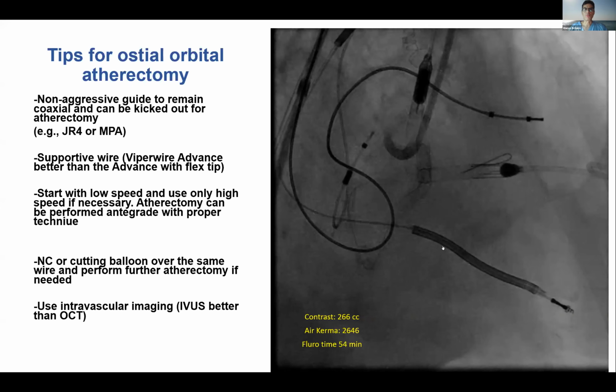The other thing, though, that I found sometimes interesting with these perforations is losing the wire. Sometimes people get a perforation, which is not the most pleasant thing, obviously, in the world, and then next thing, panic comes into the room, and next thing you know, now you've lost your wire. So what would you do next if this were to happen to you? Knock on wood.